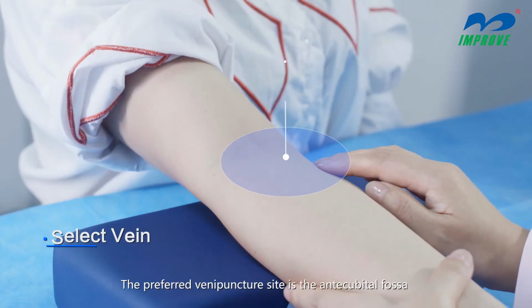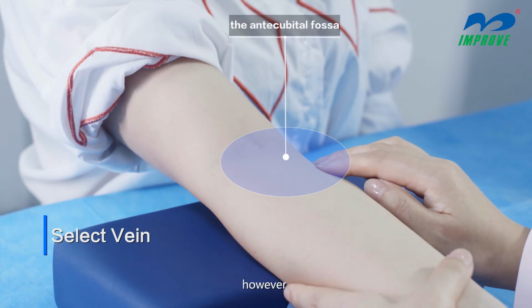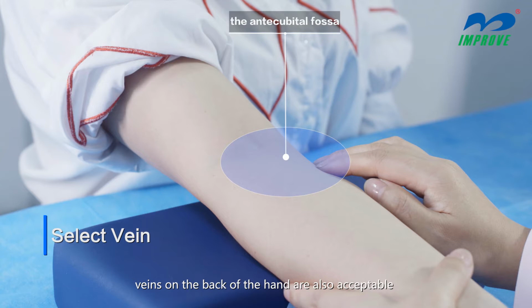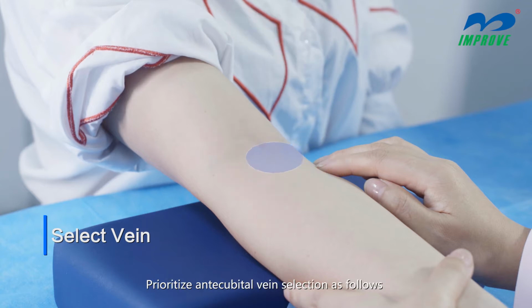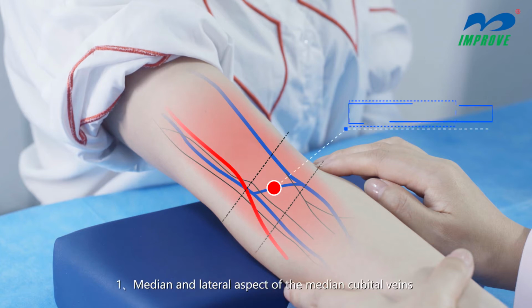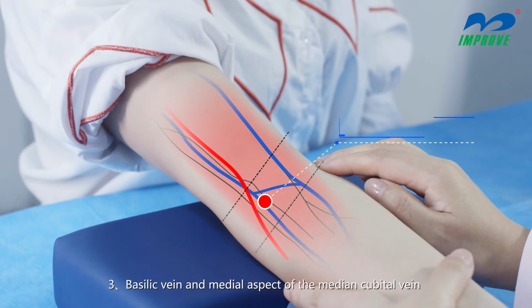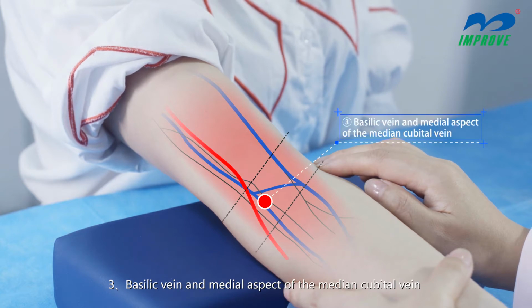The preferred venipuncture site is the antecubital fossa. However, veins on the back of the hand are also acceptable. Prioritize antecubital vein selection as follows. 1. Median and lateral aspect of the median cubital veins. 2. Cephalic vein and the accessory cephalic vein. 3. Basilic vein and medial aspect of the median cubital vein.